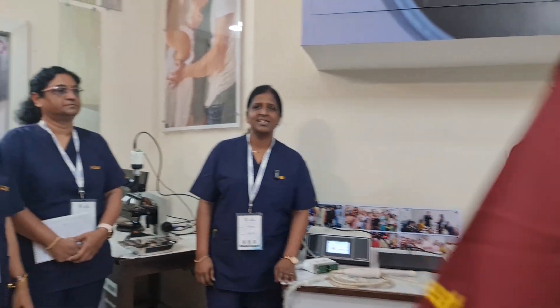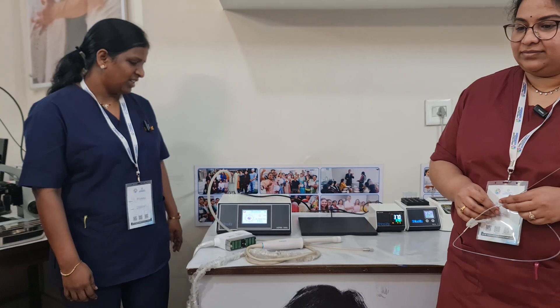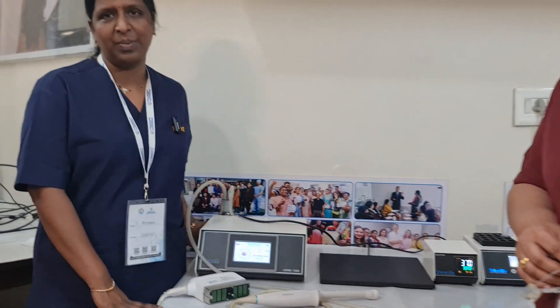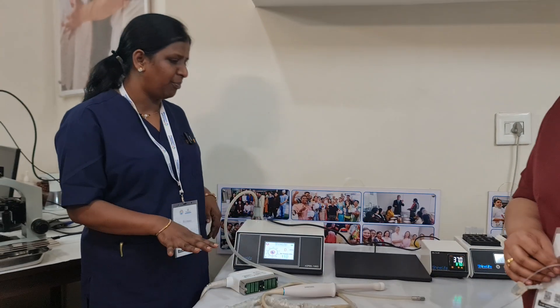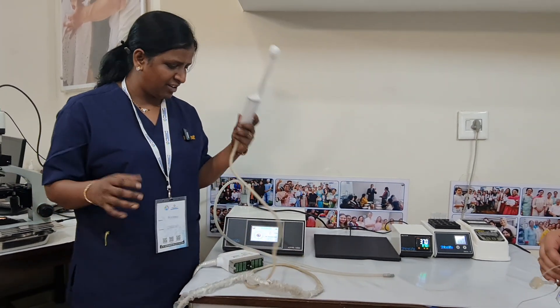Hello, good afternoon to everyone. This is Dr. Madhavi from Andhra Pradesh. I am here for two days at ICT Academy for the C3 course, and today my topic is briefing the equipment which is needed for ovum pickup.